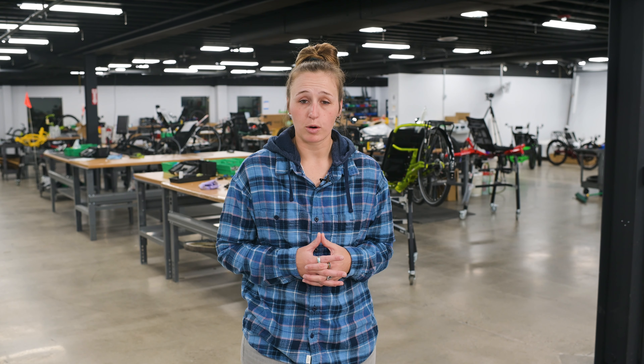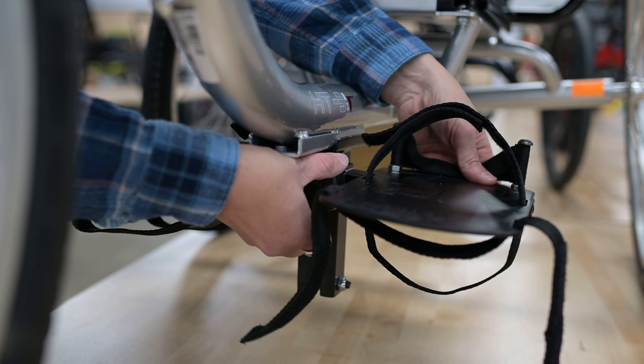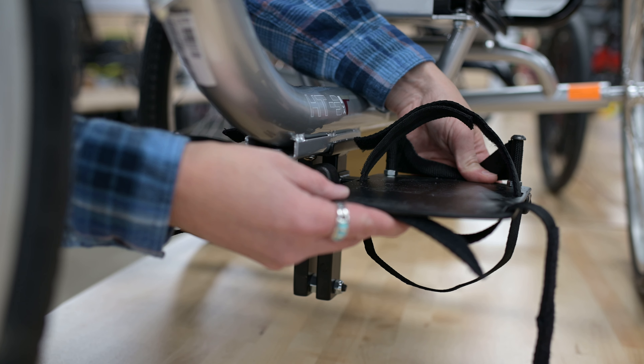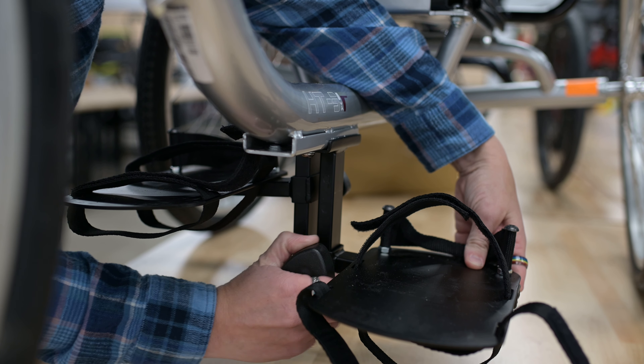The upright seat has a permanent seat angle of seven degrees, but it can be adjusted forward and backward by pulling a small lever underneath the right side of the seat. The foot rests can also be adjusted up or down to maximize the rider's comfort — simply loosen the set screws and lower or raise the footrests to your preferred position.